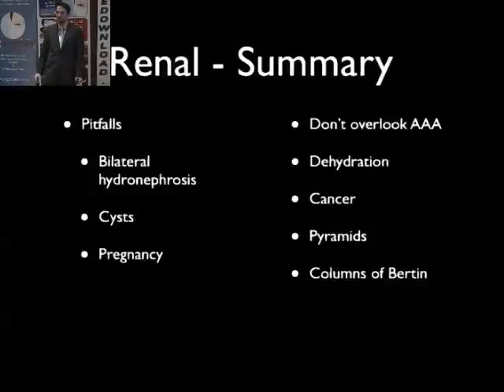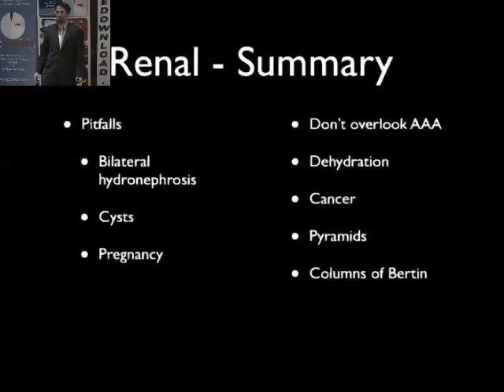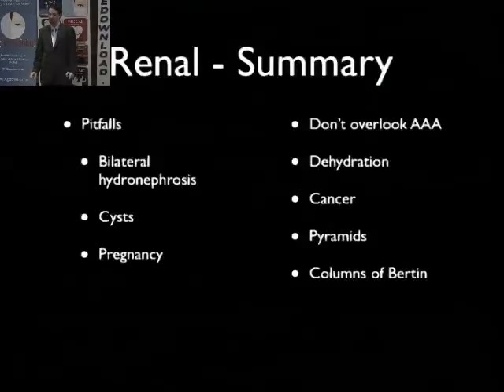It's not abnormal. Remember not to overlook AAA, sort of one of those standard board questions, right? The patient comes in with flank pain and some hematuria, and you chalk it up to a stone. It was actually a rupturing AAA. If the patient's very dehydrated, they might have a stone, and you might not be able to appreciate hydronephrosis. So you can hydrate them and repeat your study 30 minutes later, and you might be able to pick up some hydronephrosis at that point. Remember, if you see something that looks abnormal, it might be cancer, assume it is, refer, get them the appropriate follow-up. Remember, the renal pyramids are going to be out in the periphery and can mimic cysts.